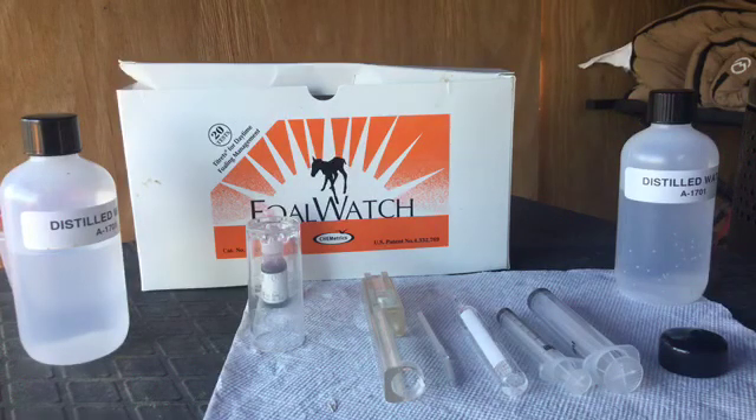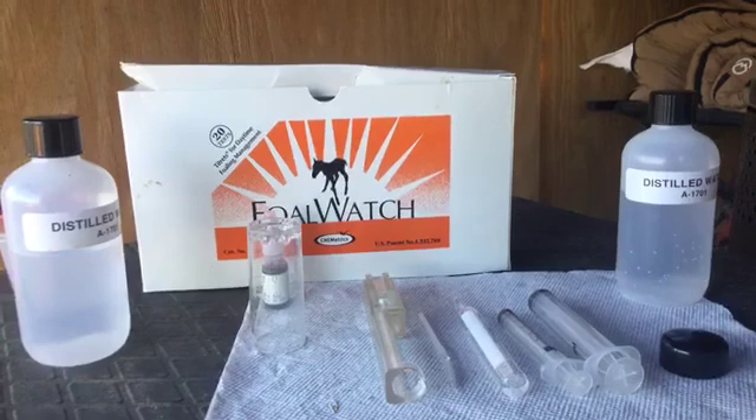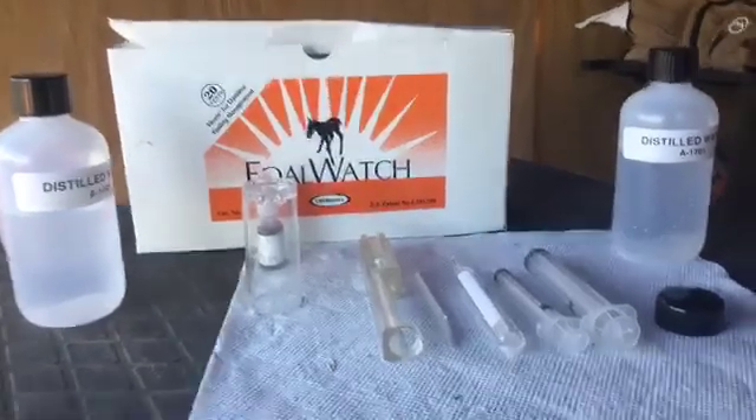Hi, you are with Raisin Roans Ranch, also known as R3. We are going to do a test kit demonstration on Blue's Cowie Valentine. We got a reading on her this morning at 100, and last night she was at 50. So we are going to see if we have FoalWatch tonight.